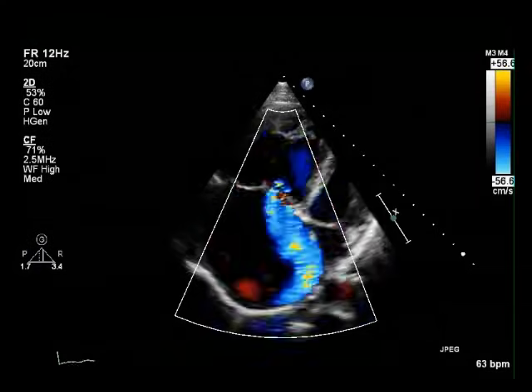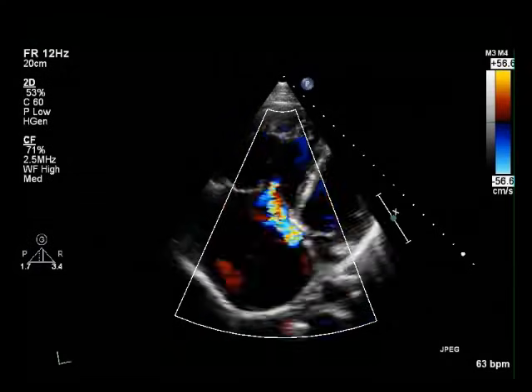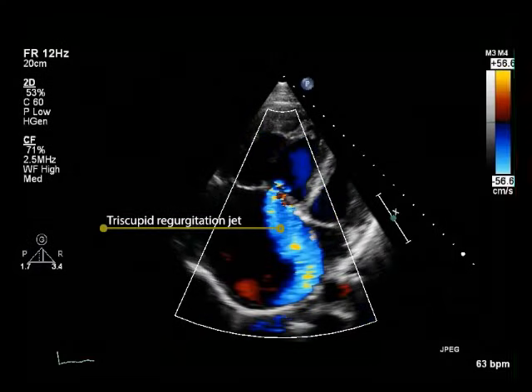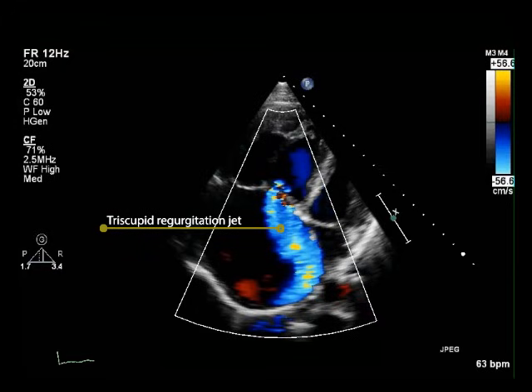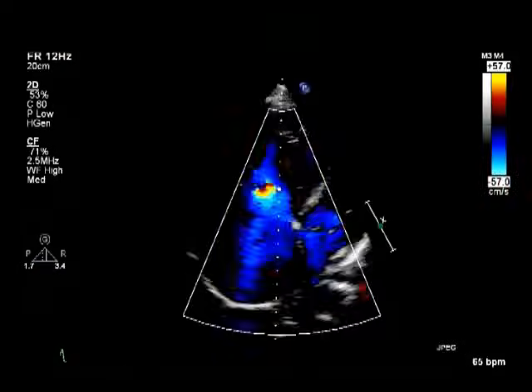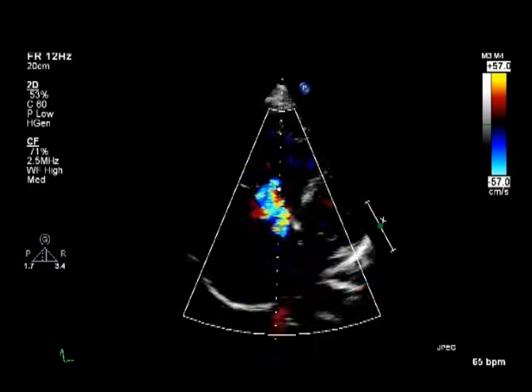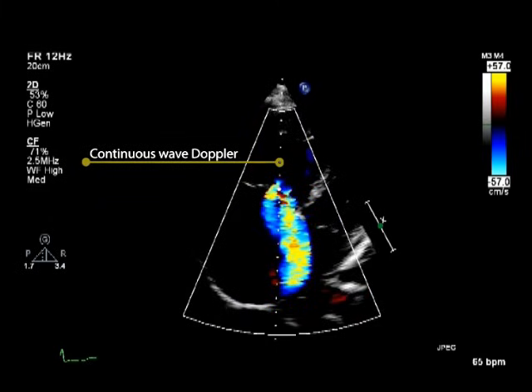Colour Doppler on the tricuspid valve in the apical four-chamber view in this patient with pulmonary hypertension shows tricuspid regurgitation. Tricuspid regurgitant velocity can be used to help estimate the likelihood of pulmonary hypertension. It is derived from the application of the continuous wave Doppler across the tricuspid regurgitant jet.